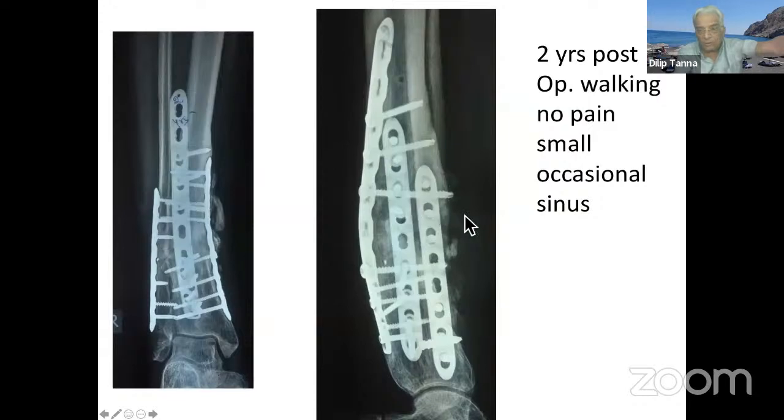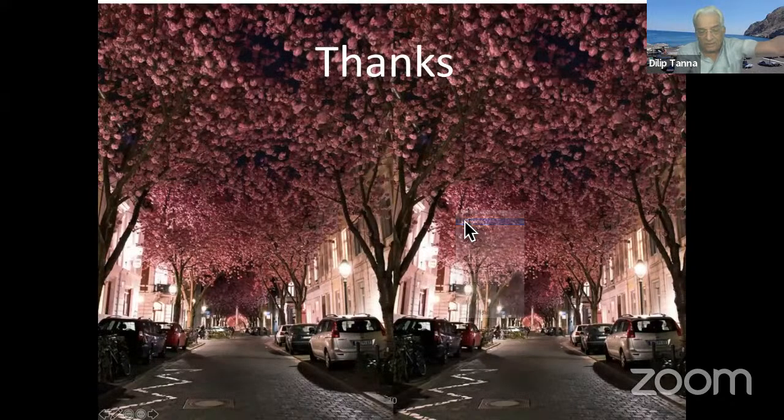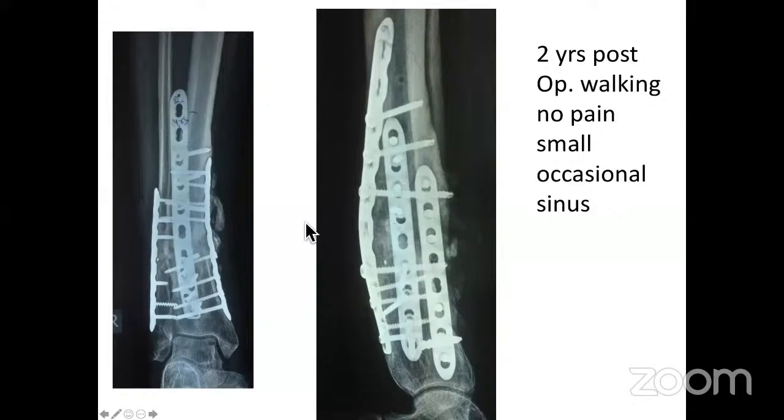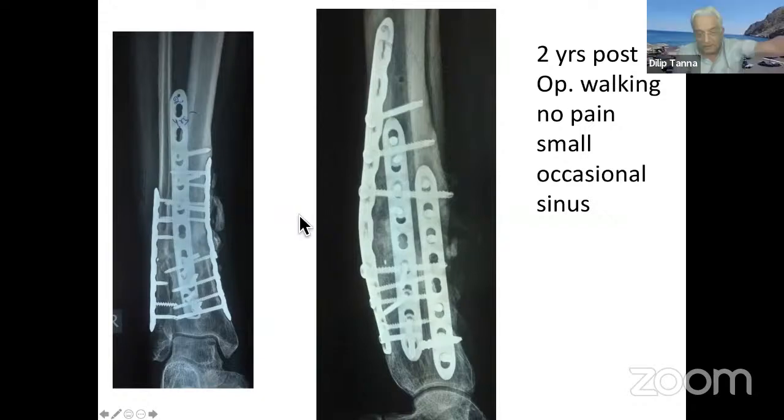2 years post-op, walking, no pain, small occasional sinus. The sinus was the one which was bothering him. So this is how it is. And later on, I think I removed the plate and everything. Now what happened was the screws were broken. I think I'll find over the day the implant removal images.